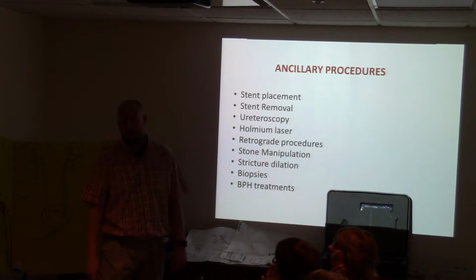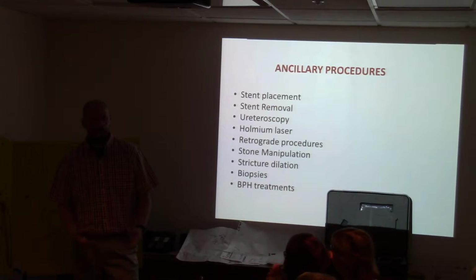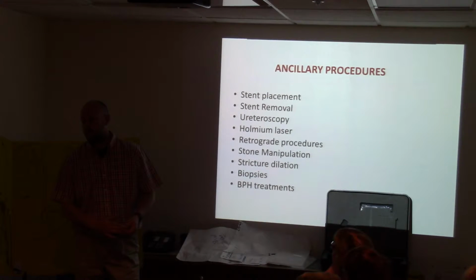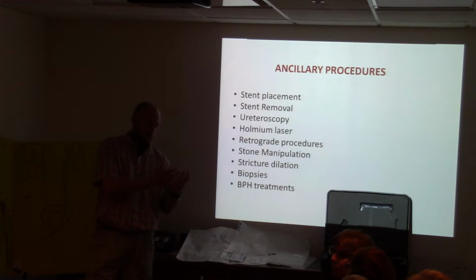There are different color stones, and actually different shapes, sizes, and different compositions of stone. So a uric acid stone does not show up on x-ray, so that's one that you would need contrast for. There's some real dark, gross looking stones like blackish and yellow. And then there's some just white stones, some with jagged edges, some smooth. The smooth ones are actually harder to break than the ones with jagged edges. And lithotripsy, what lithotripsy does is when we administer the shock, that compression wave goes through the stone. It hits the back of the stone and refracts back through the stone, and that wave going through and coming back actually shakes that stone apart.